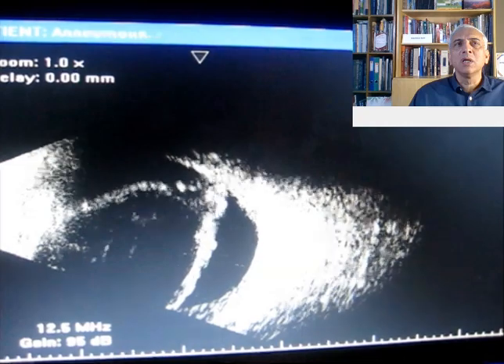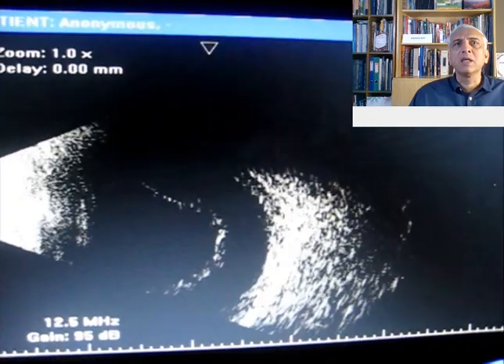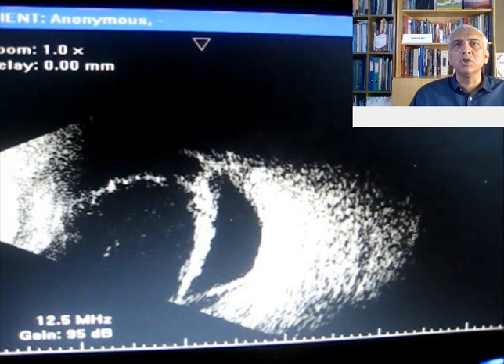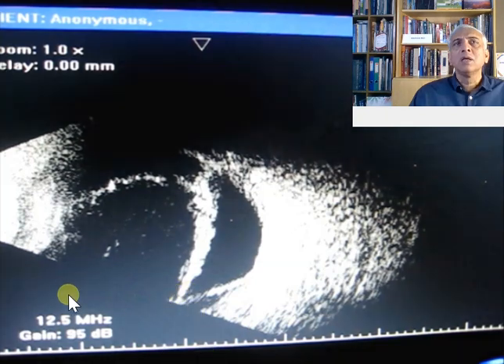So in this patient, you can see there is definitely a detachment of the retina. There's a V-shaped appearance of the retina. If you had an A scan along with it over here, you would have 100% reflectivity, and that would represent the retina in these cases.